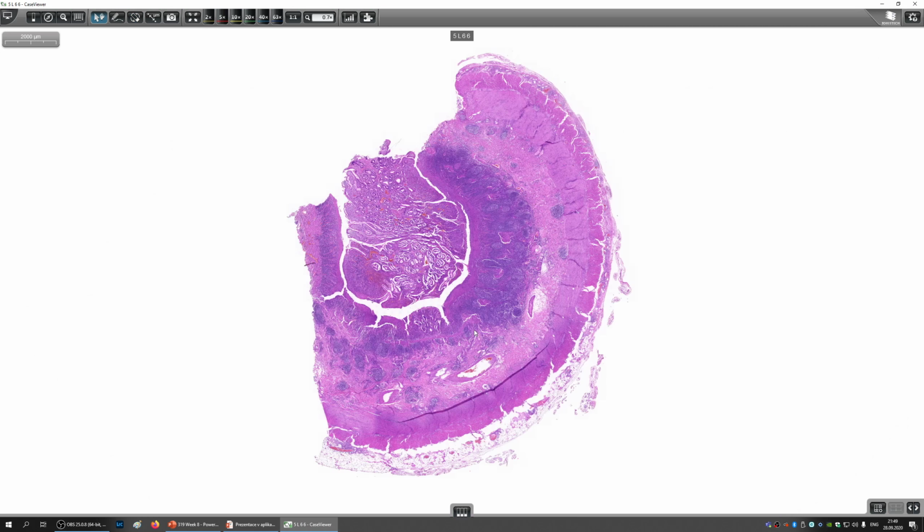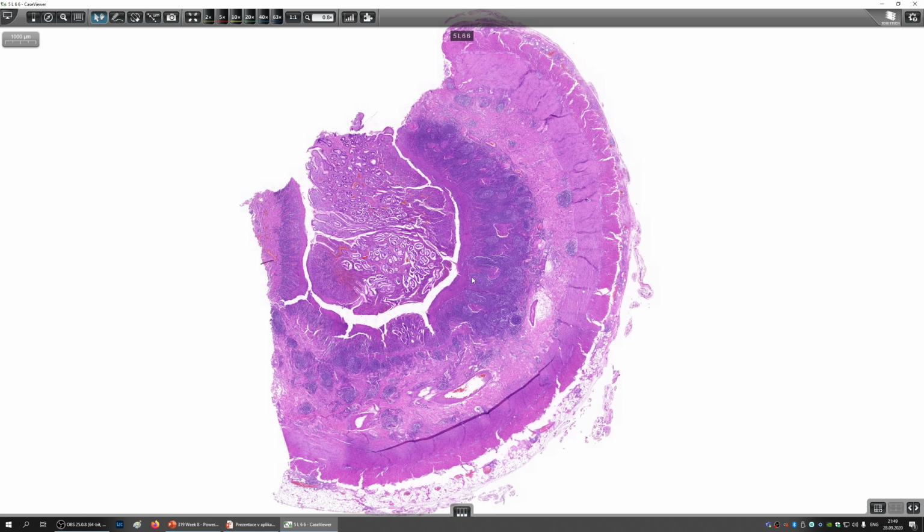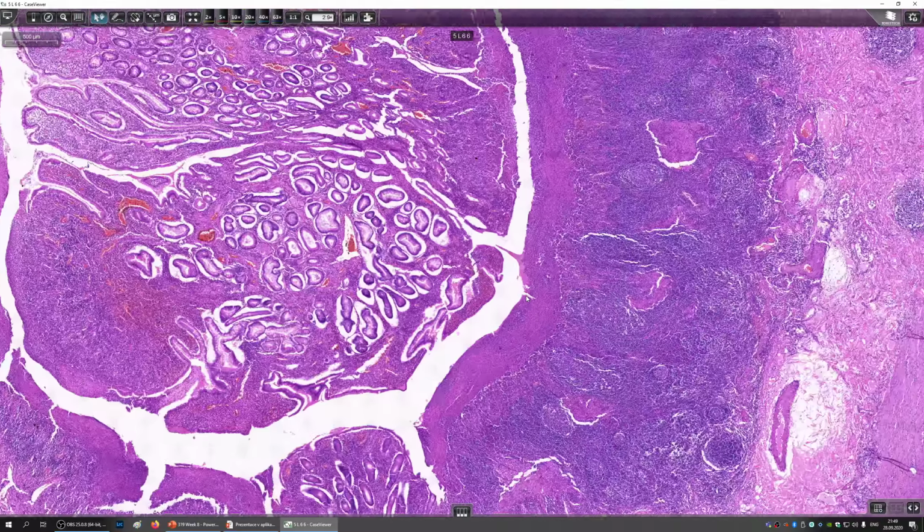So Crohn's disease likes to affect the small intestine, especially the terminal ileum, which I'm going to guess this is the terminal ileum. So you can see immediately that the mucosa is quite hyperplastic. It has been widened, enlarged by the inflammation. So we go close.